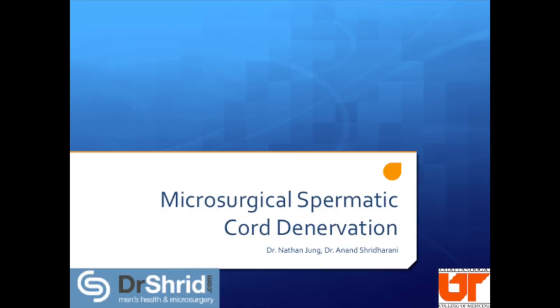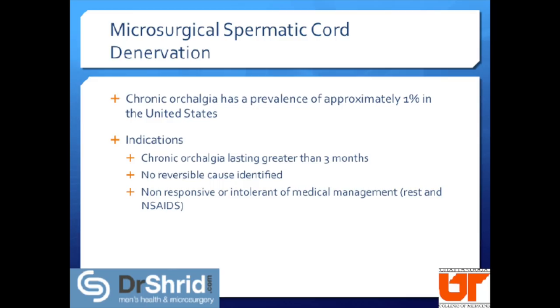In this video, we present our technique for microsurgical spermatic cord denervation with and without sparing of the vas. Chronic orchialgia has a prevalence of approximately 1%.